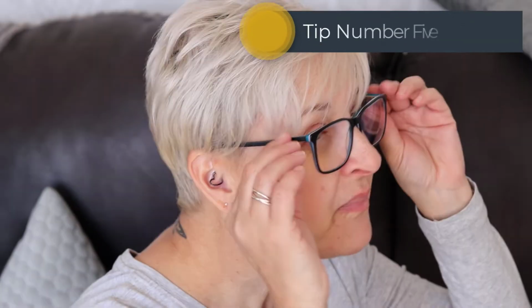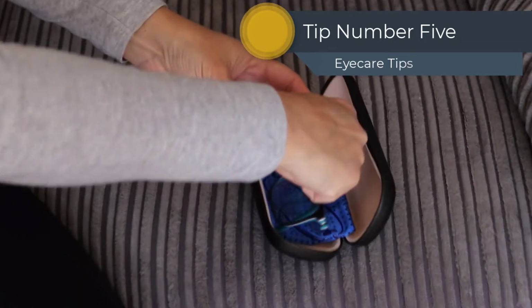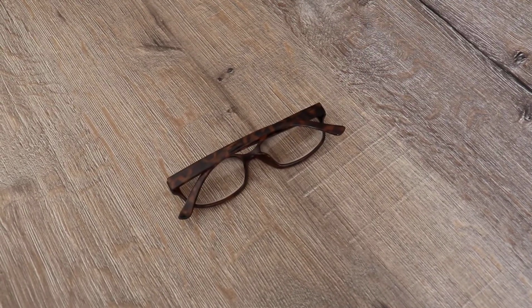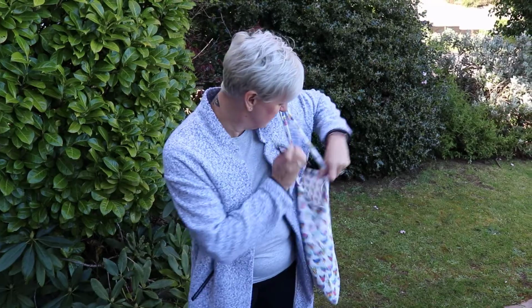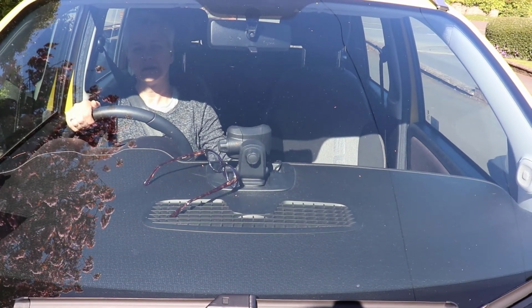And tip number 5 is to always place your spectacles in their dedicated case to protect them when you're not wearing them. Never rest them down on a surface lens first, or place them unprotected in bags or pockets, as this can cause scratching. Also, never leave them on hot surfaces such as your car dashboard in hot weather, as this can cause the frame to bend or warp.